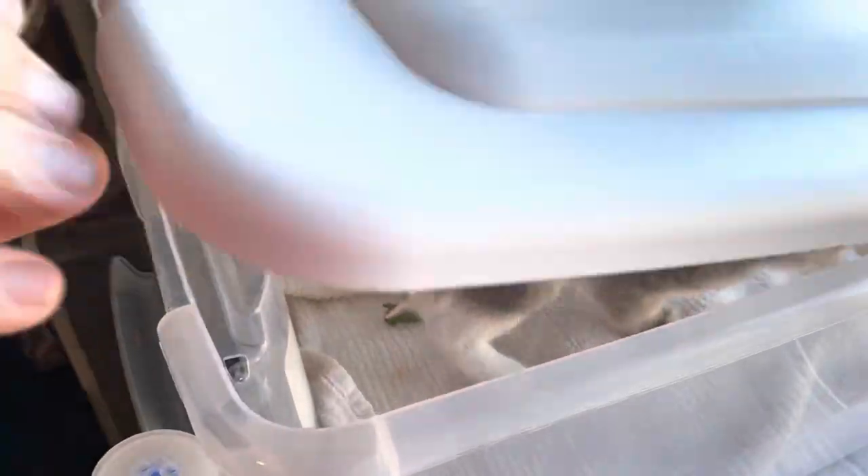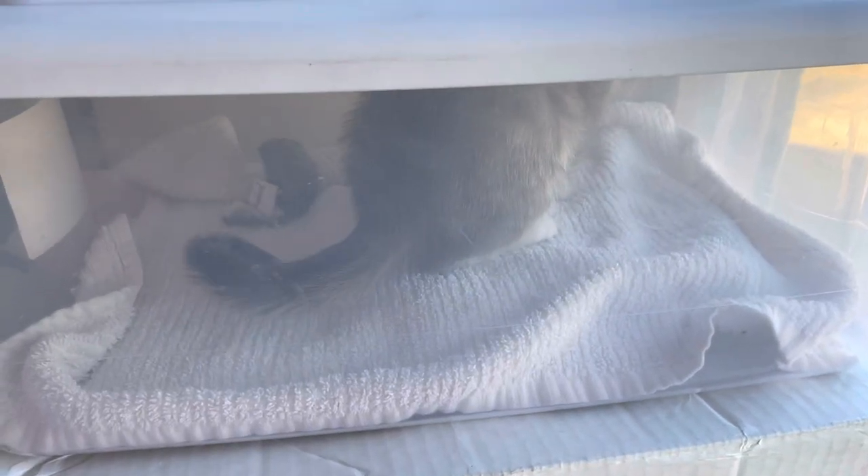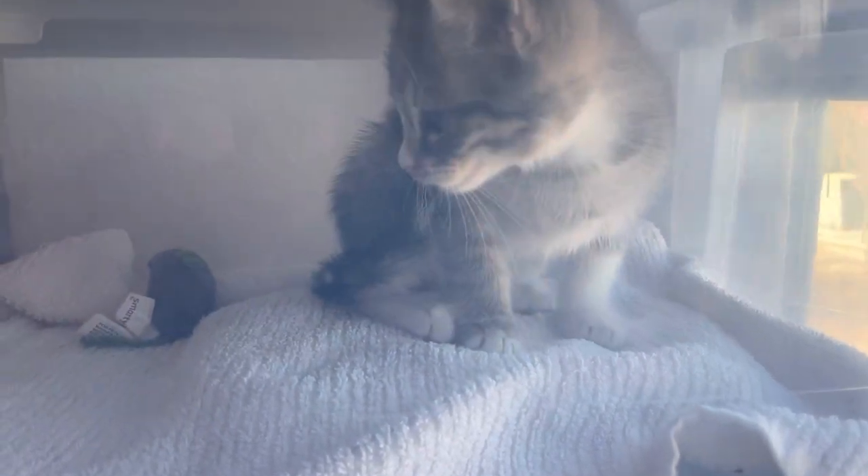You can actually do more than one kitten at a time. There are two holes drilled in the back and one at the bottom to allow passive air to go in, so there's no worry about them not getting enough oxygen. It's about 10 to 20 minutes, twice a day.